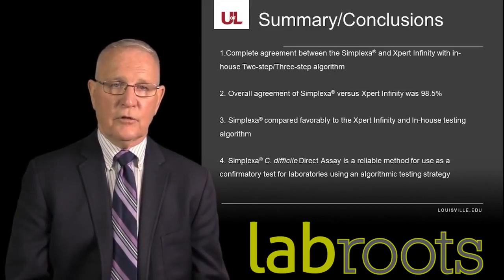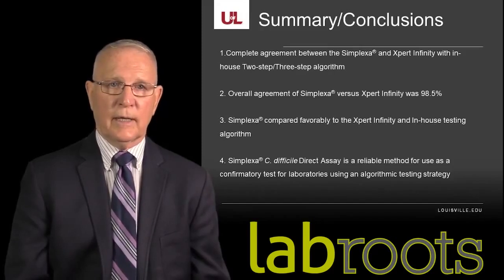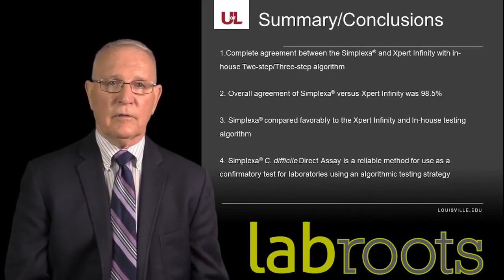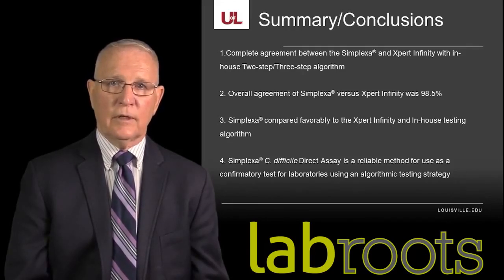But once again, the jury is still out regarding the use of direct PCR or the algorithmic approach. Hopefully some publications that will be coming out in the next year will add clarification to the situation that we're currently dealing with. And I can honestly say that physicians are really challenged when they get a positive PCR result back. Challenged from the perspective of, do I treat it, do I not treat it, and what does this all mean?